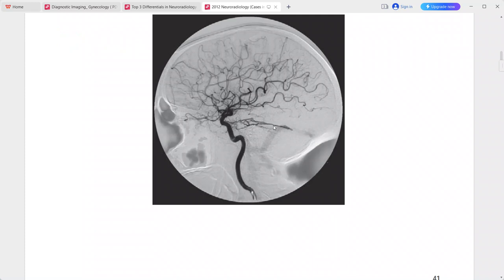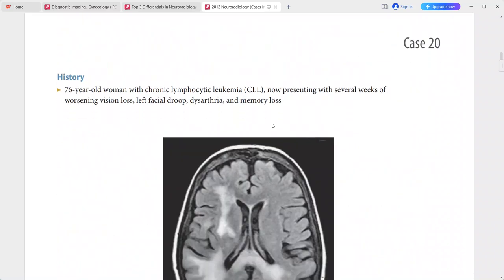ICA injection shows several dural branches arising from the cavernous ICA supplying the fistula. There is no cortical venous reflux. This is a case of dural arteriovenous fistula. Differentials include AVM and vascular tumor such as glomus jugulare or glomus tympanicum.